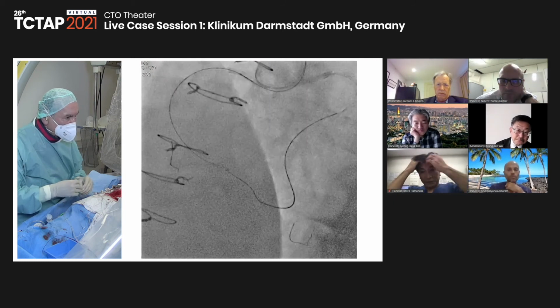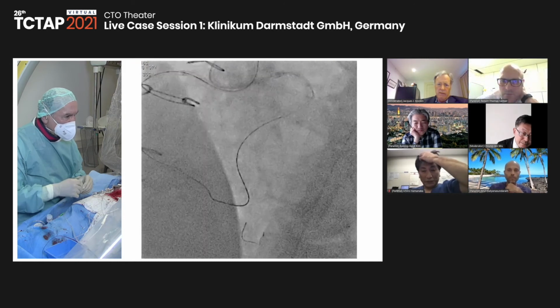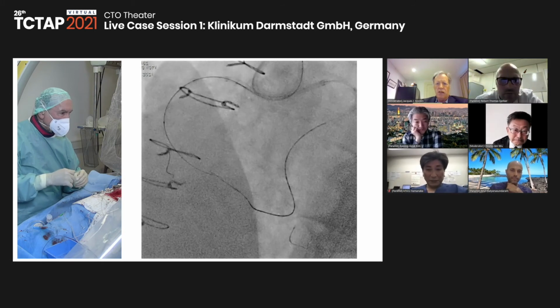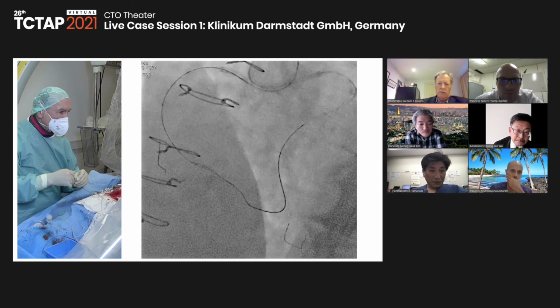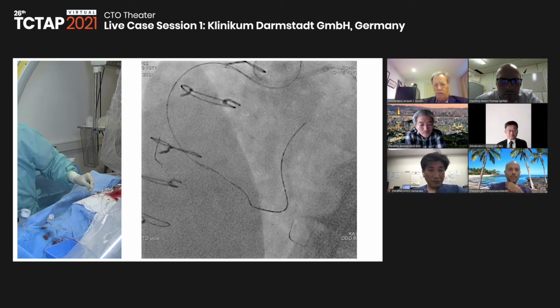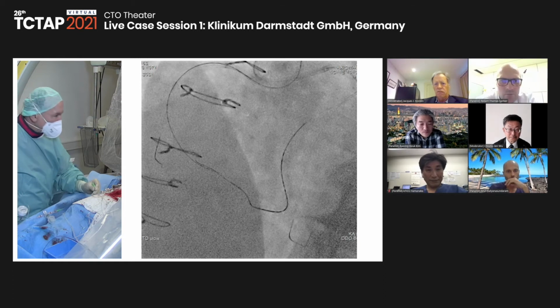We have not yet dilated this segment, yeah. But very close. You see, we make progress here. Great progress. Almost overlapping. Yeah, it is overlapping. We can dilate here, across the balloon. Yeah, perfect. Dilate. Yeah, 10, 12. We show the A plane, the other plane.